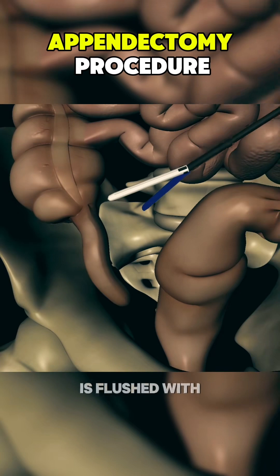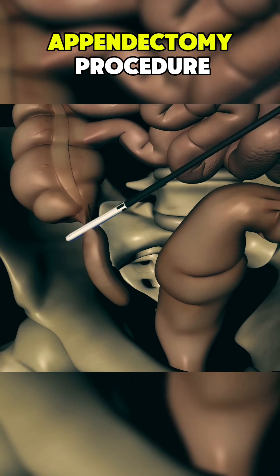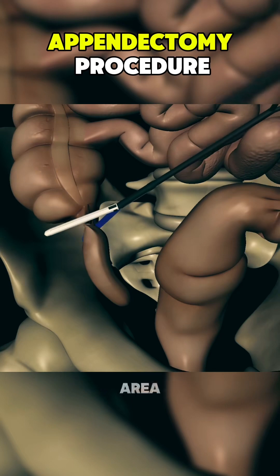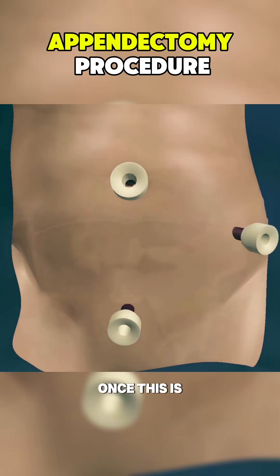The abdominal cavity is flushed with sterile saline to remove any traces of infection, after which the surgeon inspects the area to ensure no other issues are present.